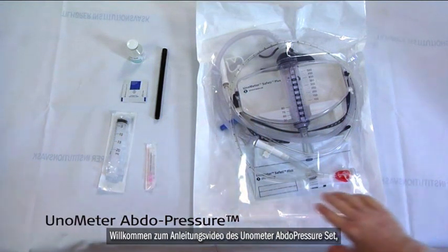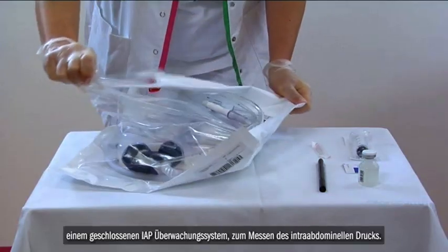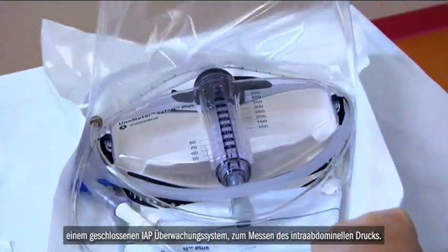Welcome to the training video of the Unometer Abdo Pressure Kit from UNO Medical, used to monitor the intra-abdominal pressure.